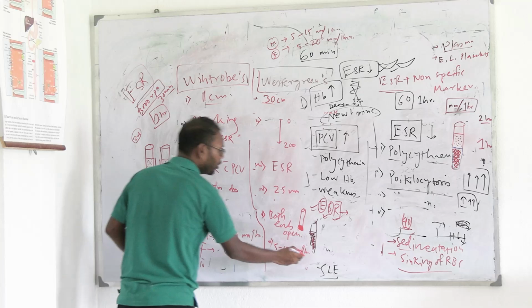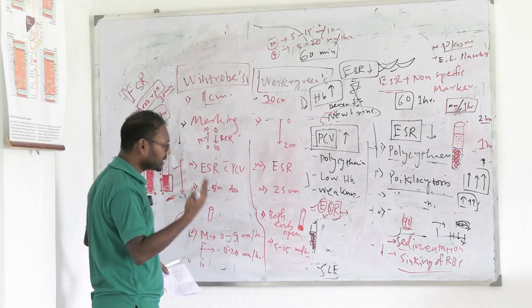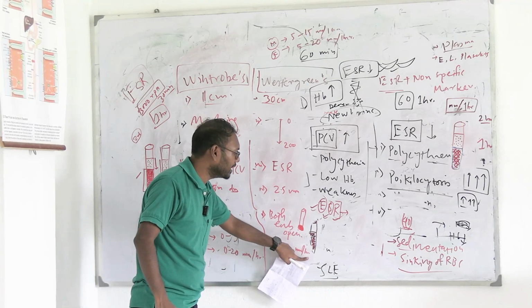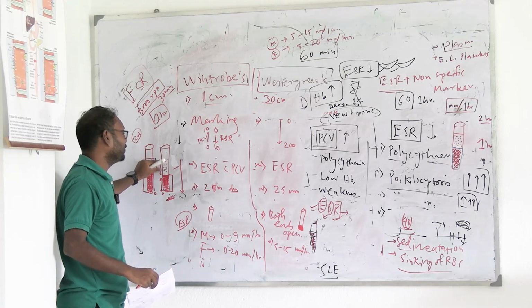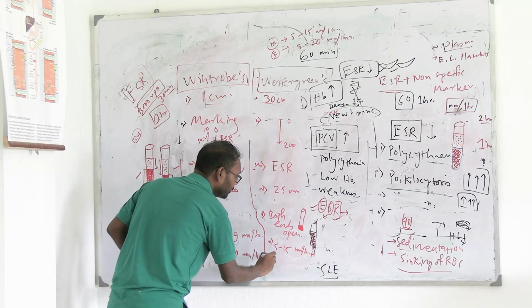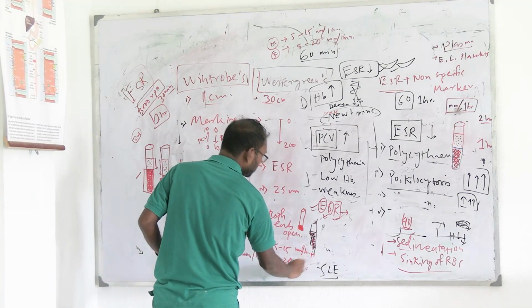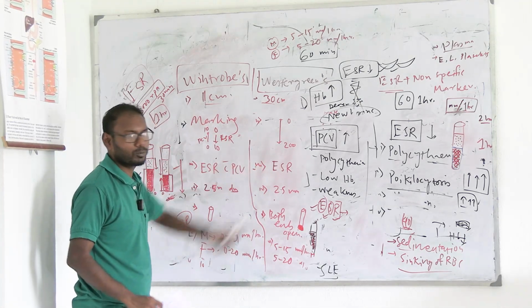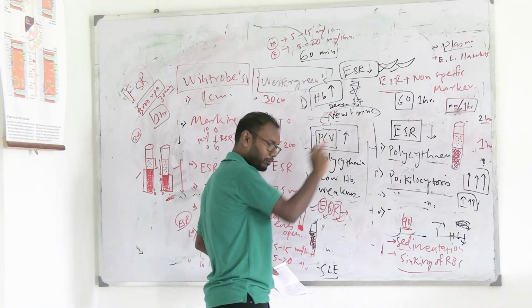And the hour is important because if you measure after 2 hours your ESR will change. So you will have to mention after which time you have measured your ESR. So এই জন্য বারবার আমরা এখানে hour কথাটা লিখি। After 1 hour I have noticed descendance of 5 to 15 millimeter. ঠিক আছে? So this is normal for male, and in case of female it is 5 to 20 millimeter per hour. So এখন মেল ফিমেল কেন আলাদা হয় আমরা এক্ষুনি ডিসকাস করব যখন আমরা ক্লিনিক্যাল ডিসকাশনে যাব। ঠিক আছে? সো রেট কেন বলছি আমরা ক্লিয়ার করে নিলাম। ঠিক আছে?